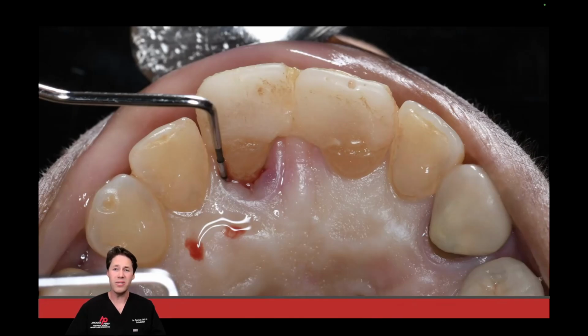So this brings out another teaching point. If I have two periodontal defects, let's say there's a periodontal defect on number 9, which there isn't, but let's say there is, and let's say the tissue quality, let's say it's the same defect on 8 and 9, but the tissue on 8 is inflamed and the tissue on 9 looks healthy.